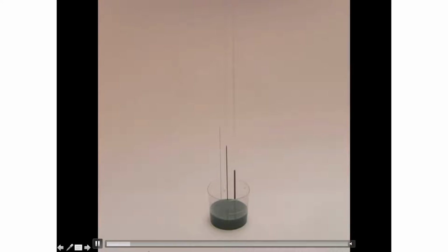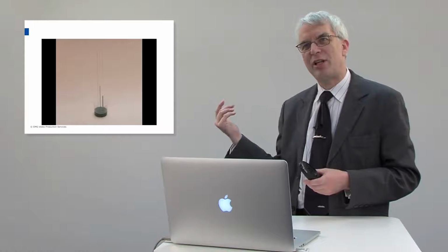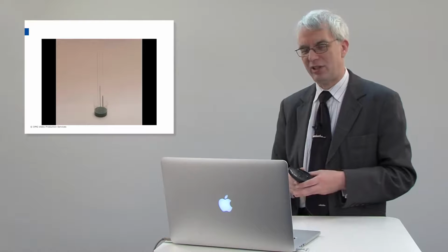So we have these three capillaries here, big one, medium one, and a small one. And you can see on the small one that it's still going, while the others are finished already. It's still going, all the time going. So we learn a bit about this. First thing we learn is that a big capillary is very quick in sucking up the liquid. But we don't have big capillaries, we have small capillaries. And for this reason, we need time for our product to infiltrate the caries lesion.